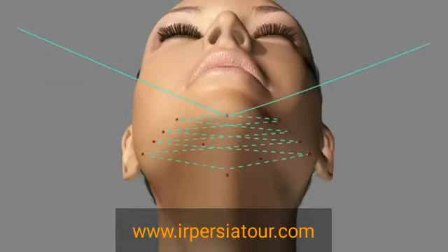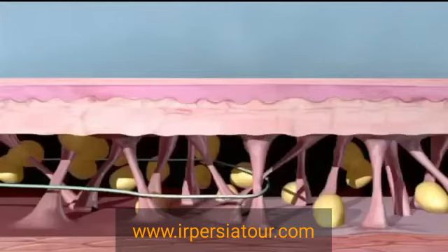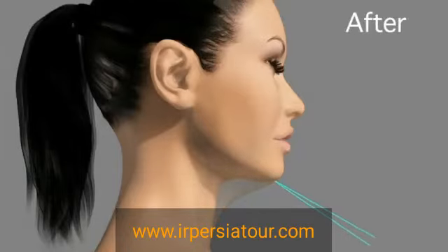Upon completion, the two ends of the suture are tightened, and the suture rods are cut free. The assistant puts gentle upward pressure in the submandibular area, thus helping to place tension on the suture matrix. The appropriate amount of tension of the trampoline is obtained when there is visual dimpling of the two anterior anchor points along the lateral ramus, as well as visible tension lines underneath the jawline. This dimpling and the tension lines resolve in most patients within 24 to 48 hours.